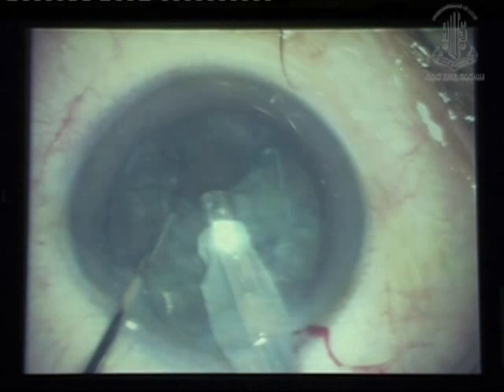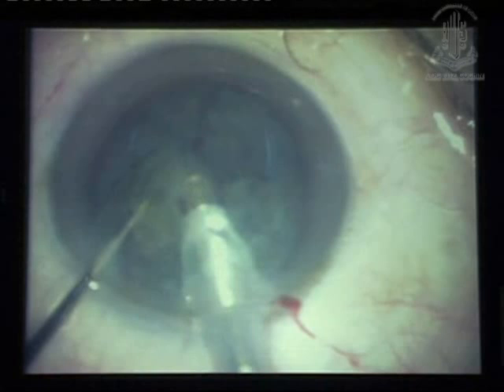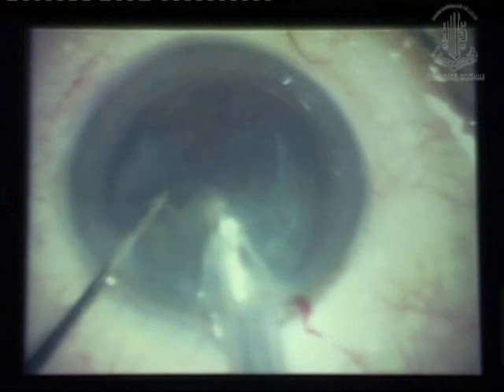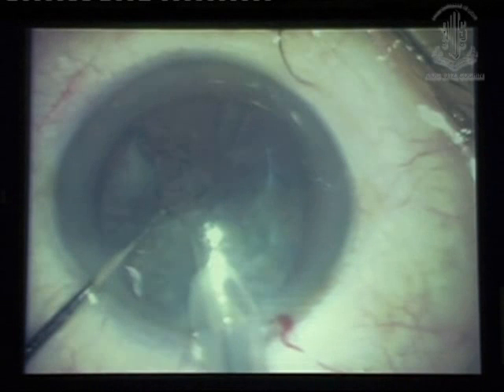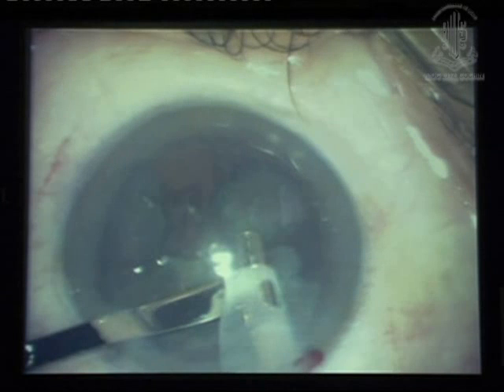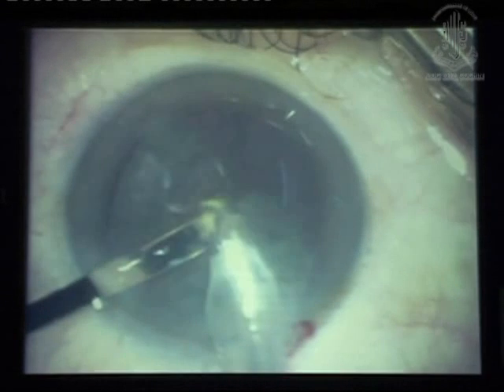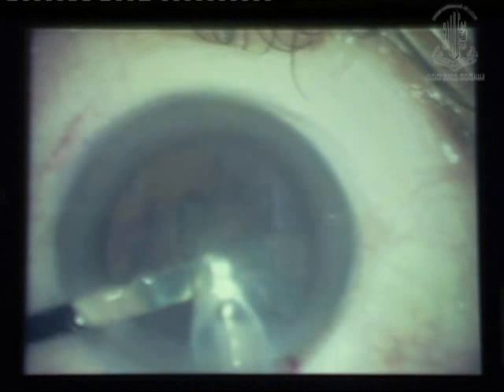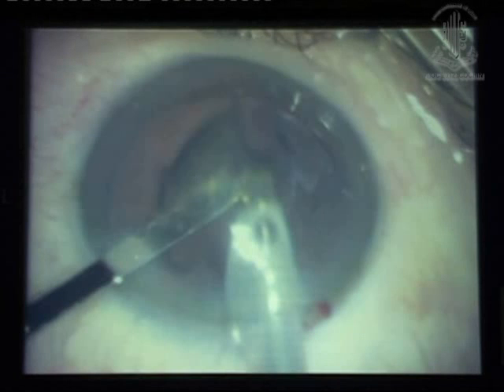There. I have actually created the PC rent over here. I have a suspicion. I'm not very sure. So I go ahead and complete the FACO. Fortunately, this is a relatively soft cataract. I could do my job, making sure that my nuclear fragments are always away from the PC rent, and then remove the rest of the nucleus and epinucleus, whatever is there.